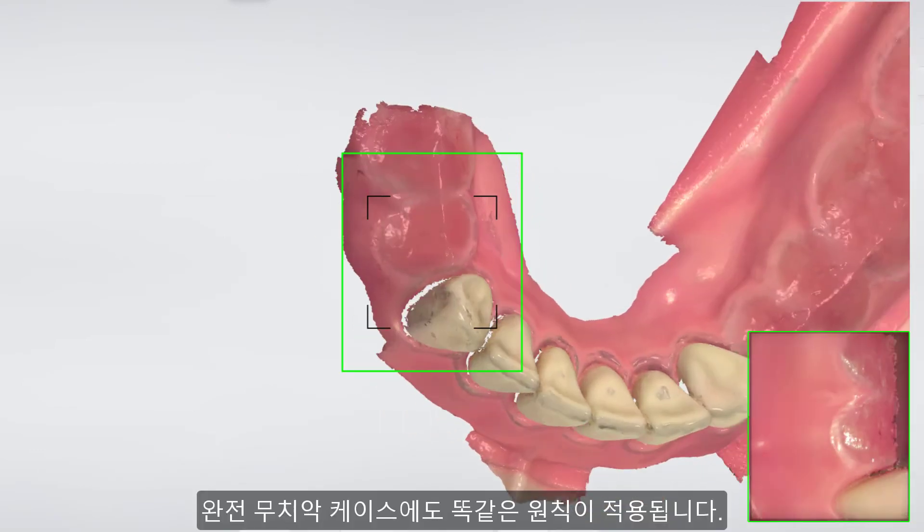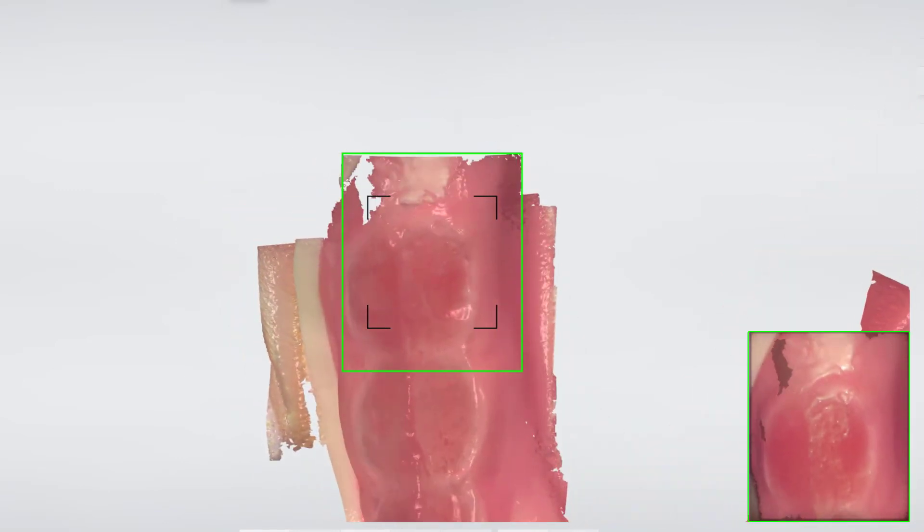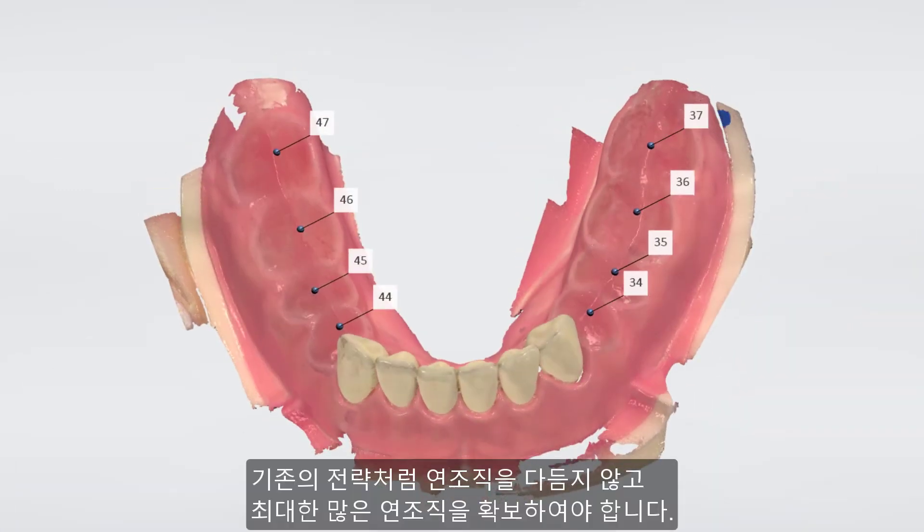The same principle applies for all edentulous areas. Do not trim away as much as you normally would, but keep as much of the soft tissue as possible.